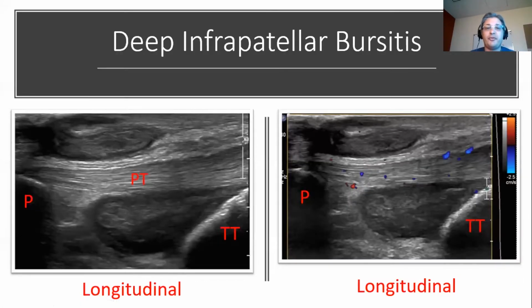Sonographically, we have some beautiful images in this patient. We have our patellar tendon here. We have our tibial tuberosity more inferiorly. And of course, we have our fibrillar patellar tendon going from one to the other. Just where you would expect the deep infrapatellar bursa to be, deep to the distal patellar tendon, we have again a complex, predominantly solid appearing soft tissue mass without significant internal flow.